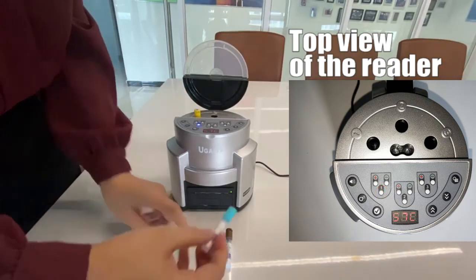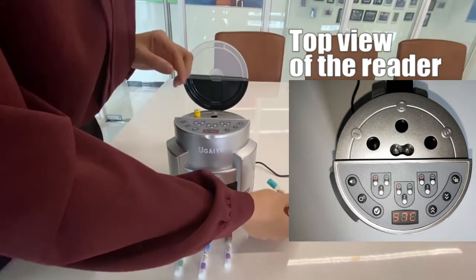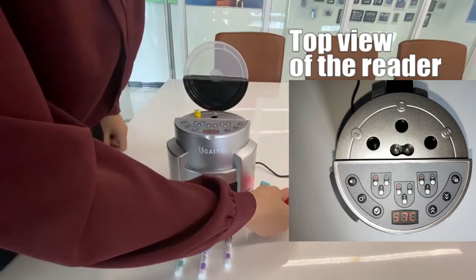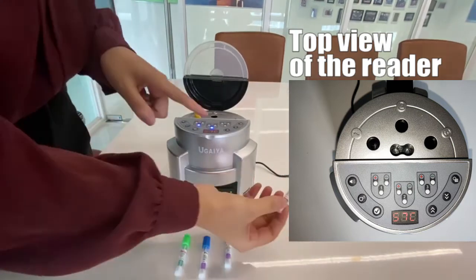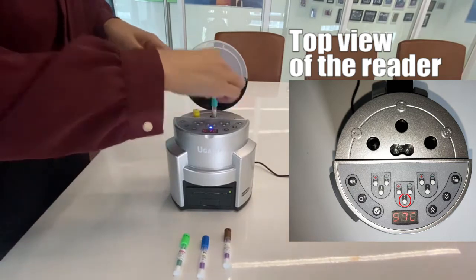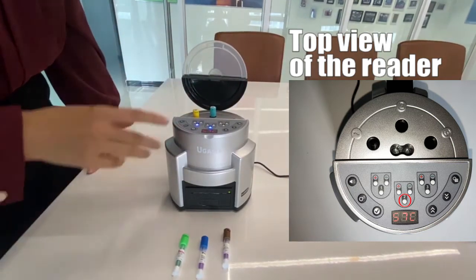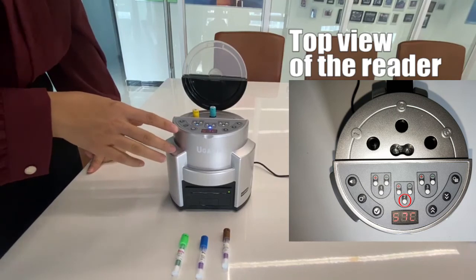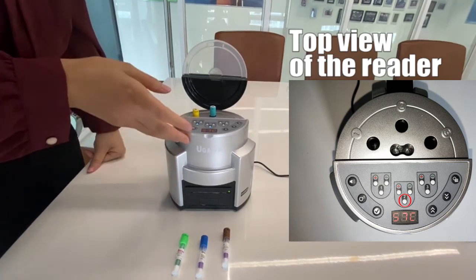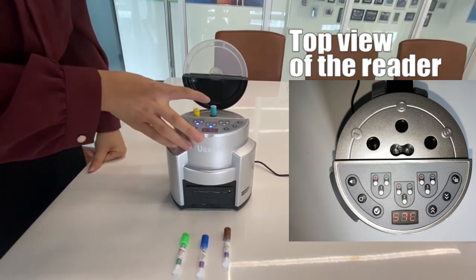Let's try another one. Press here. Number two slot — the light is on. So we put it here. Wait for a couple of seconds and you will see the light is blinking, which means the incubation is on.